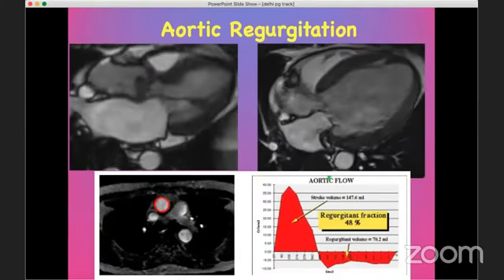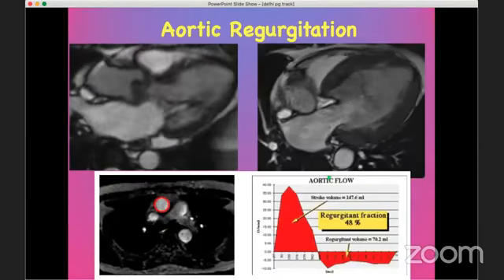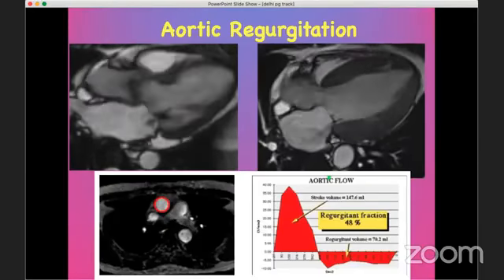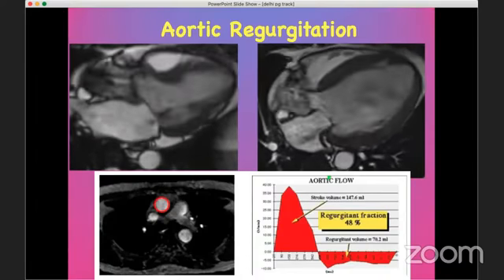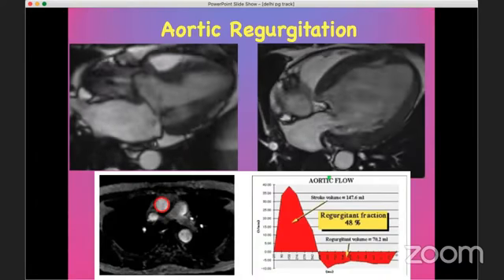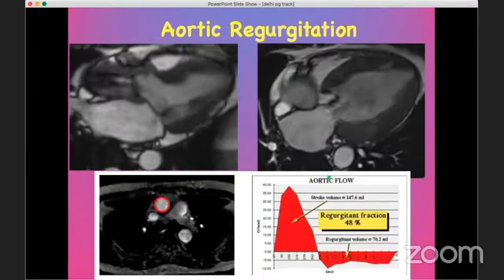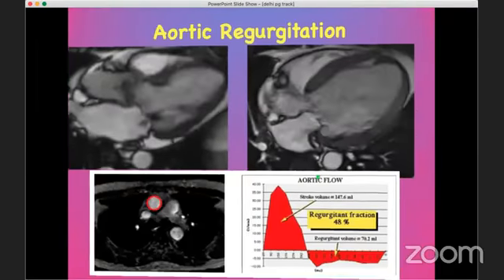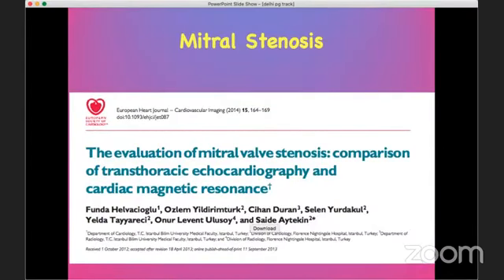So in the assessment of patients with regurgitation, especially when we are looking at the timing of surgery, because this does not involve gadolinium, which is expensive, sequential MR evaluation, possibly every 6 months in a patient with moderate to severe regurgitation, will give us the best timing when to intervene in these patients, and also act as a second umpire when there is some doubt in the echocardiogram.